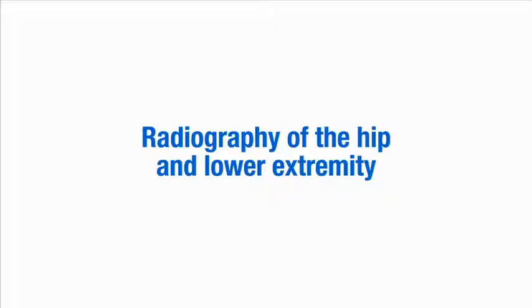This video demonstrates how to set up and perform X-rays of the hip and lower extremity. The first projection of each body region will be described in full, and subsequent radiographic projections will be described briefly, highlighting the differences only.